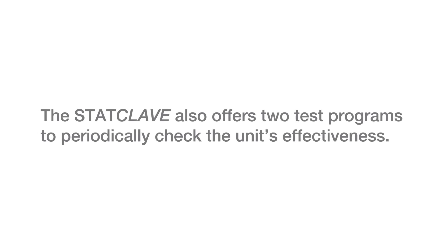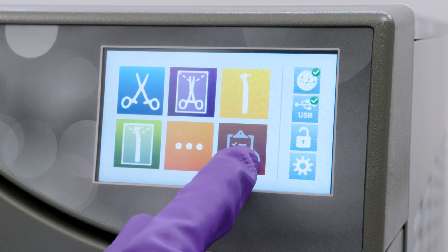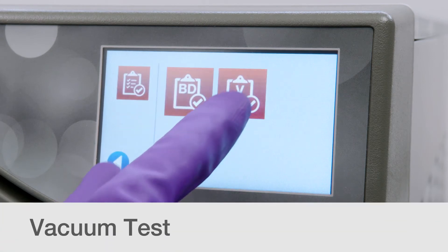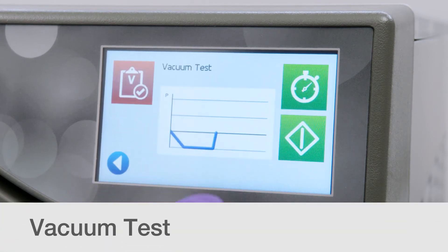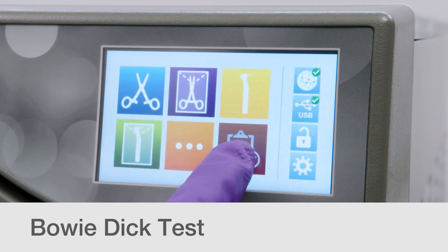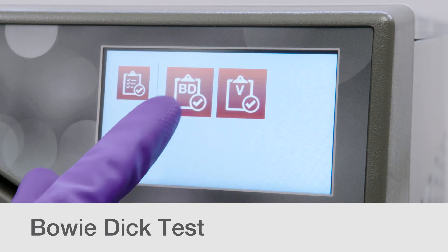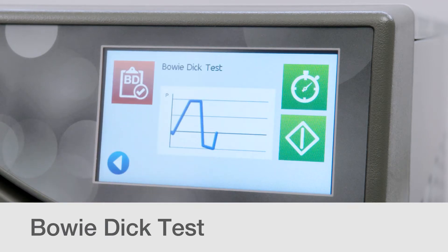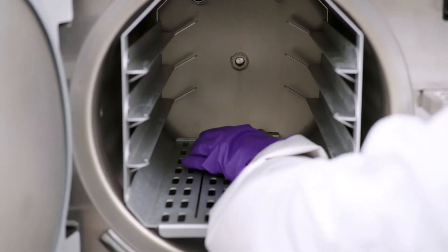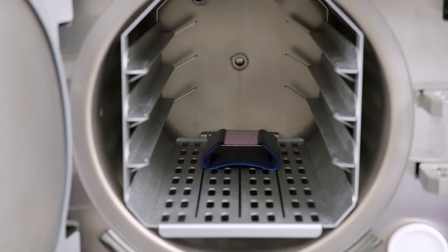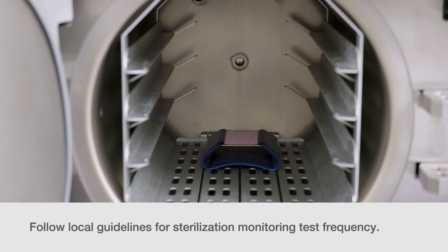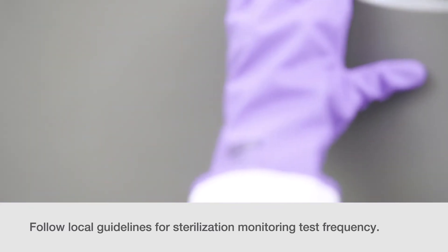The StatClave also offers two test programs to periodically check the unit's effectiveness. A vacuum test, which needs to be completed with a cold chamber. And a Bowie Dick test, which runs with only the chamber rack in place. It's done in a warm chamber with the test pack placed at the back center of the chamber. Please follow local guidelines for the required frequency for performing all sterilization monitoring tests.